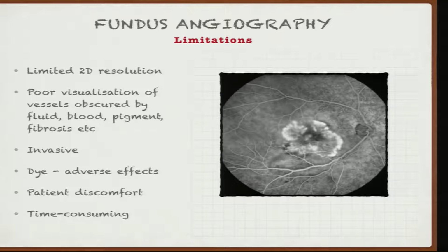Angiography is not without limitations. Of course, we have poor visualization when there is obscuration by fluid or blood. It's invasive, and the dye has its own adverse effects. It's time consuming.